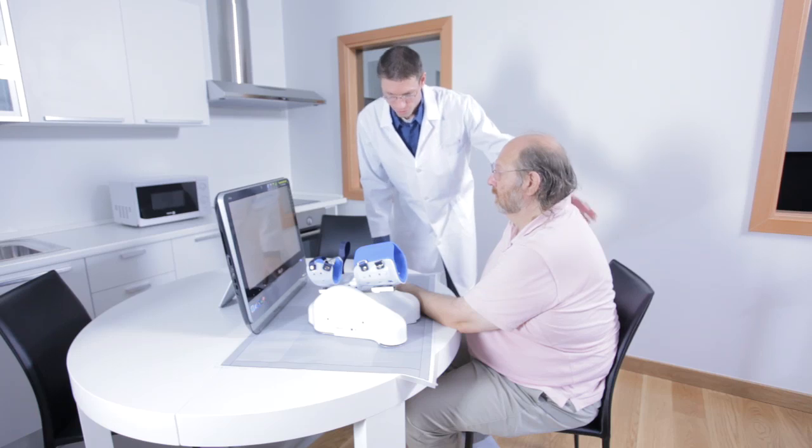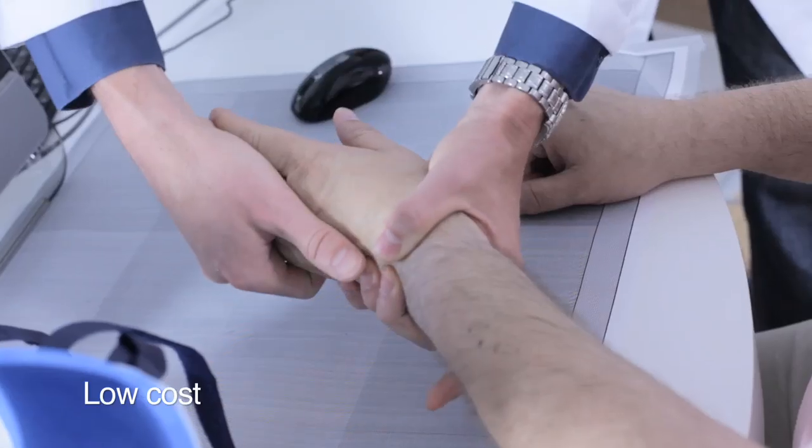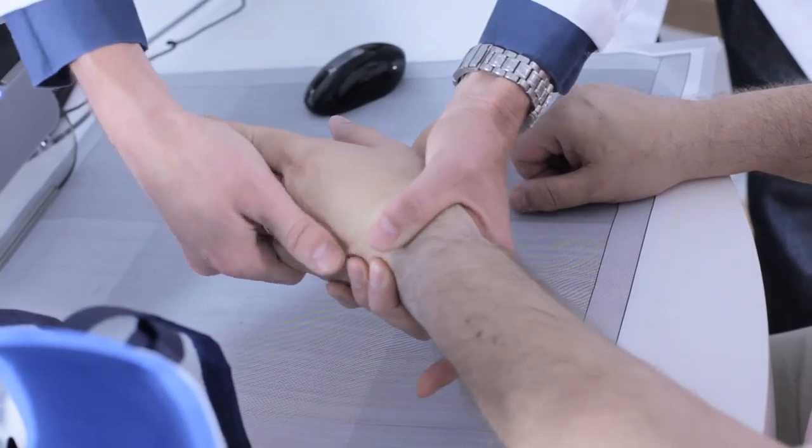The Arm Assist project aims at developing a low-cost technology for the rehabilitation of neuromuscular impairments in the upper extremities.